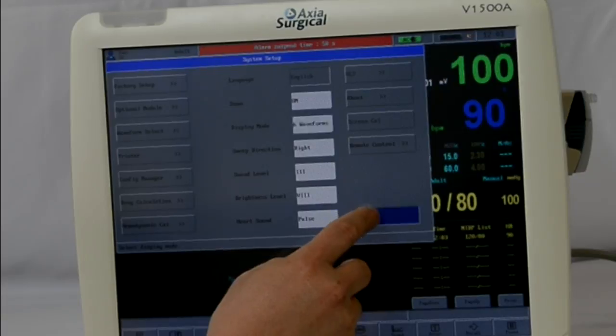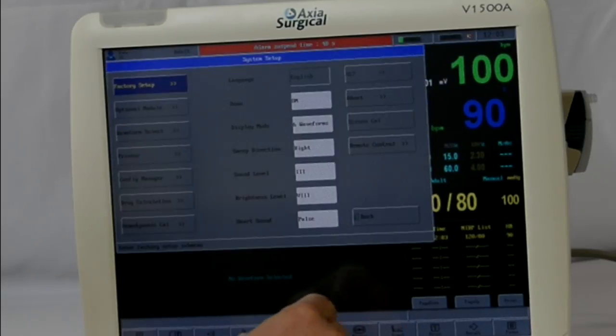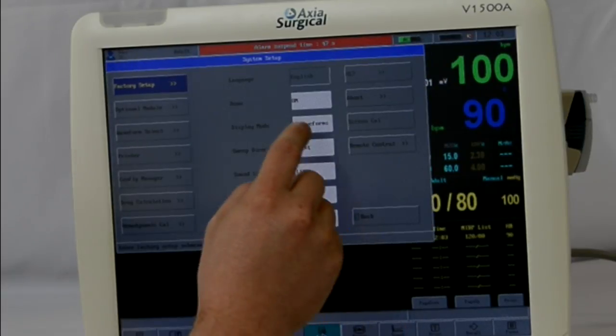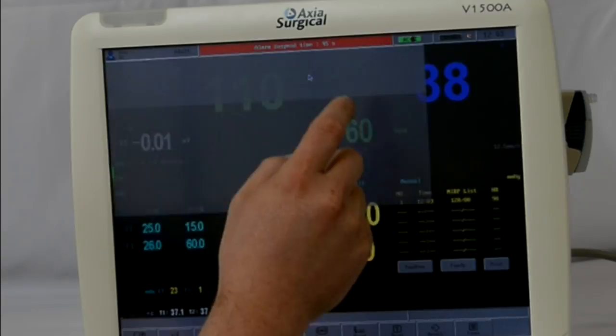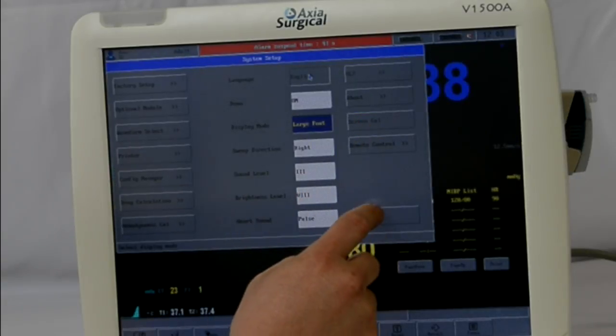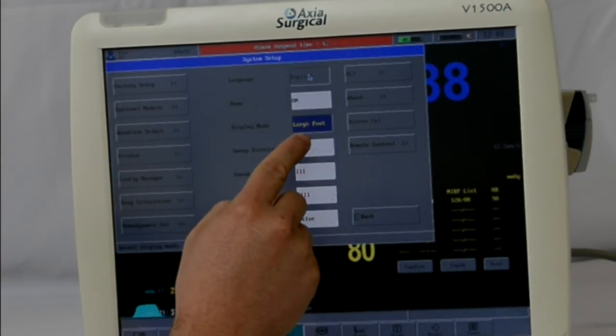Then you can exit out again. You can also adjust the font in the same area — large font increases the size. Now it says large font is on.